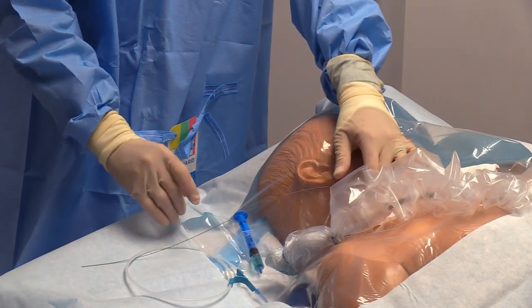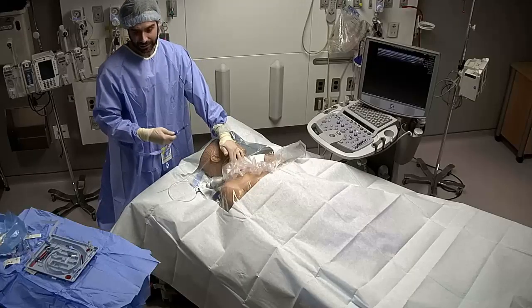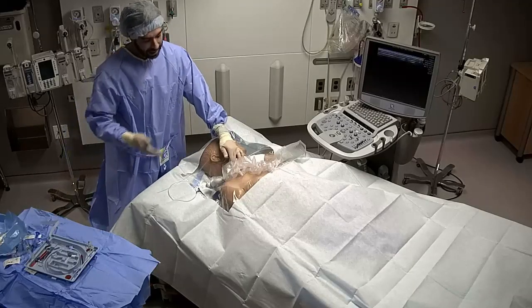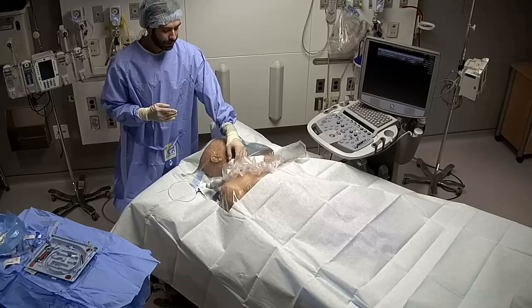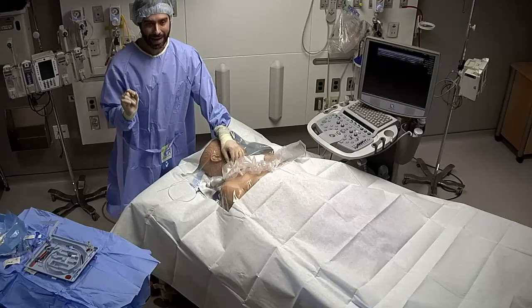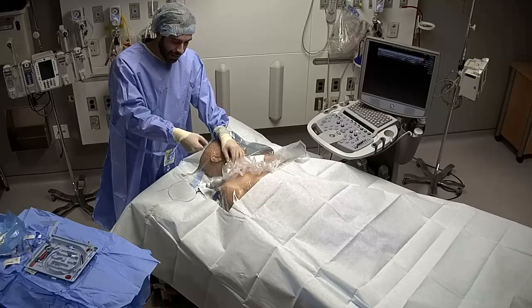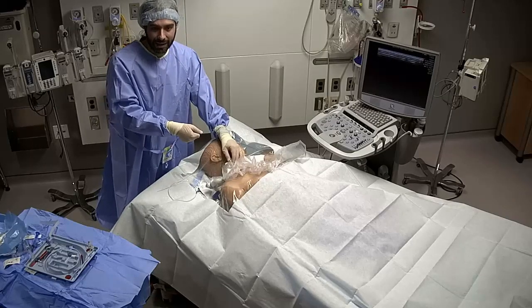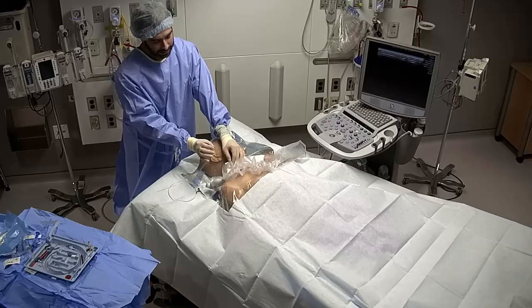So at this point, I've hopefully aspirated venous blood. I've placed the wire into the vein successfully, and I would be confirming the placement of my wire inside the vein. One of the things that is really important here is that most people, if they make a mistake here, go past the vein as they're entering with the needle. They go past the vein, and then they aspirate, they get blood flow, and then they can't pass the wire. So at that point, 90% of the time, you've just gone too deep. Got a little excited and advanced the needle.